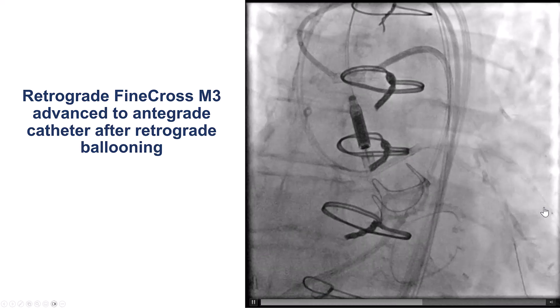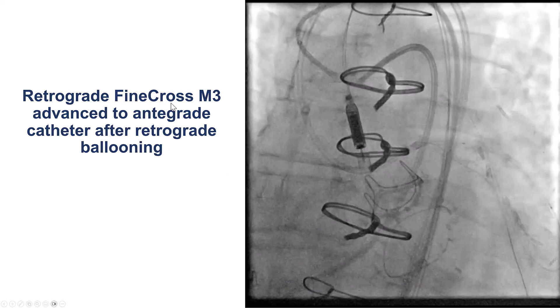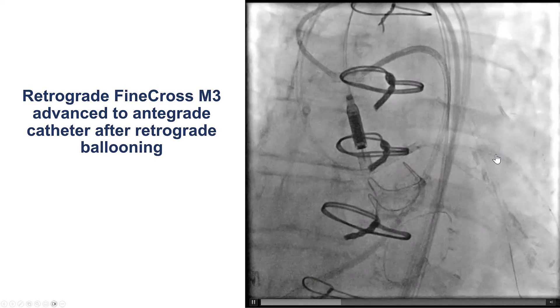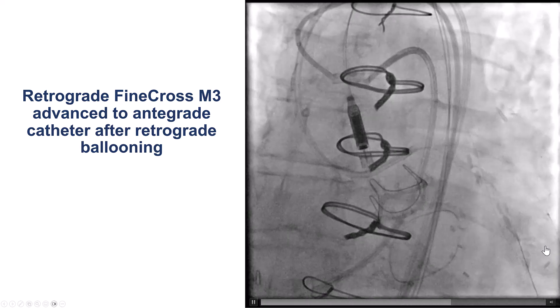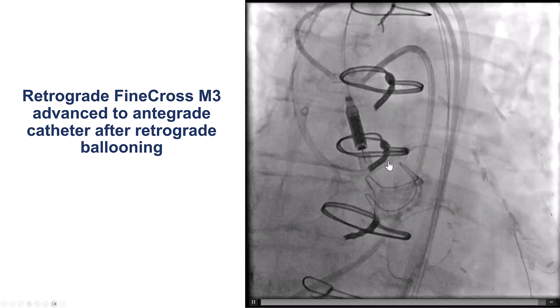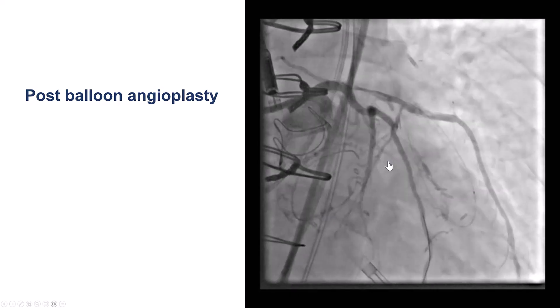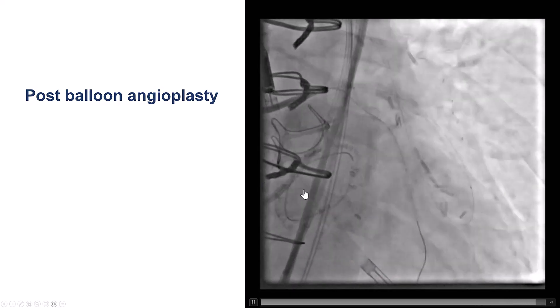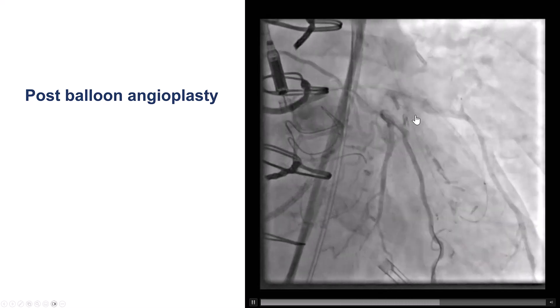At this point, we were able to change the retrograde microcatheter to the FineCross M3, which has been shown to be very crossable compared with other microcatheters. This microcatheter successfully advanced inside the antegrade guide catheter. So we externalized the wire and performed balloon angioplasty. There is some antegrade flow going through.